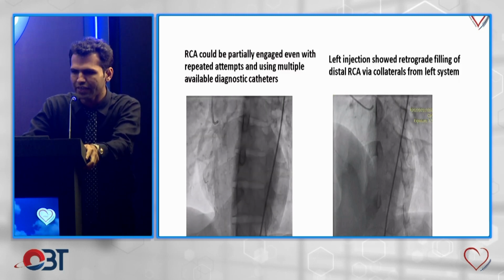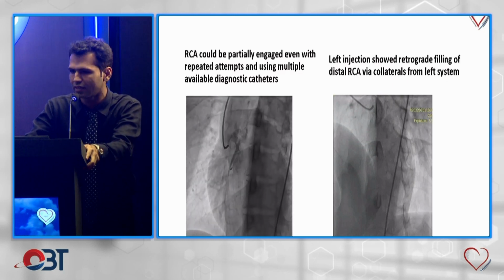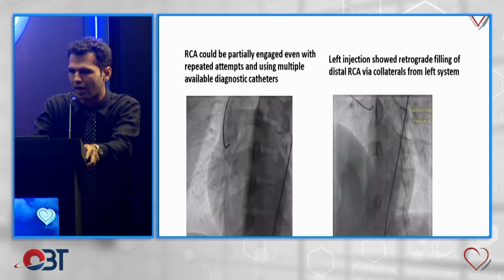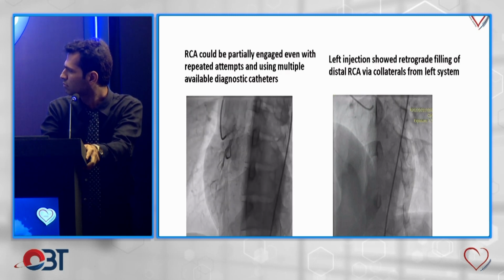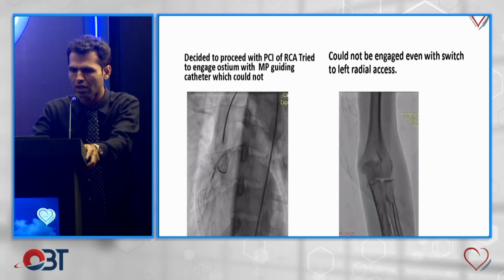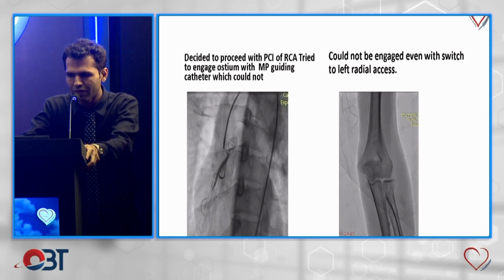RCA could be only partially engaged even with repeated attempts and using multiple available diagnostic catheters. Left injection showed retrograde filling of distal RCA via collateral from left system. So we decided to proceed for the angioplasty of RCA.